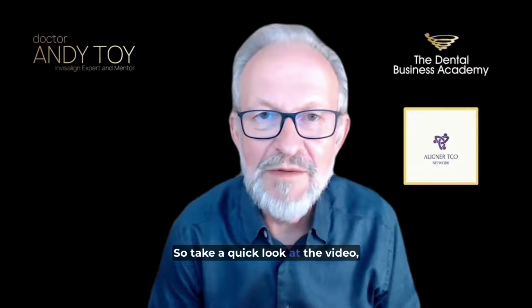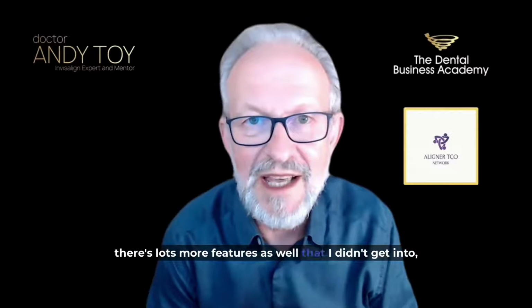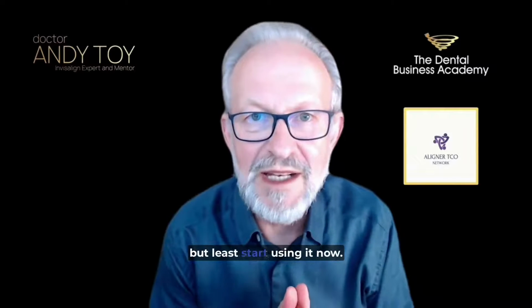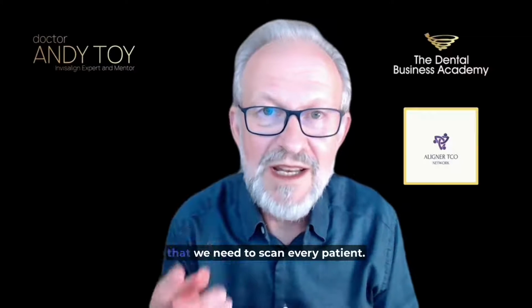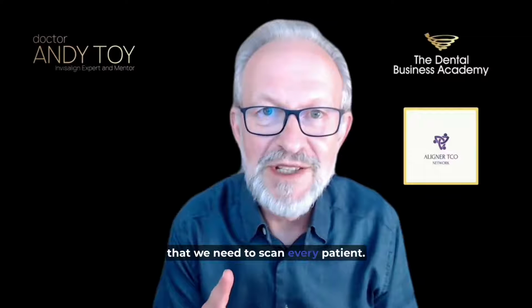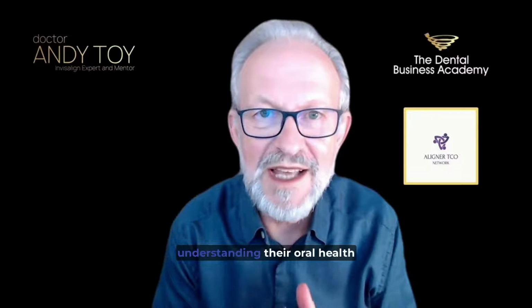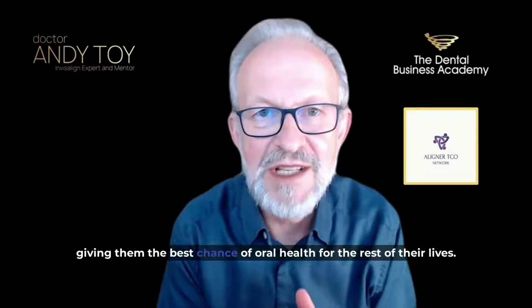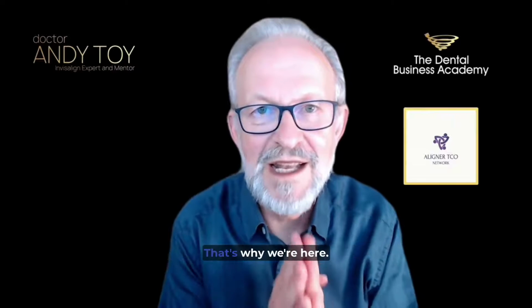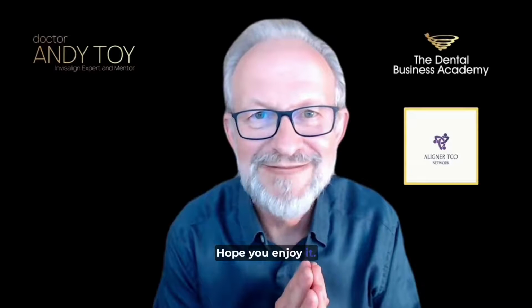So take a quick look at the video. It'll get you started in it. There's lots more features as well that I didn't get into, but at least start using it now. And it's becoming really obvious to me that we need to scan every patient. Give every patient the chance of truly understanding their oral health and getting control of that, giving them the best chance of oral health for the rest of their lives. That's why we're here. Hope you enjoy it.